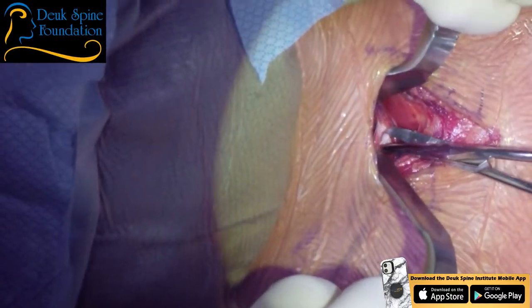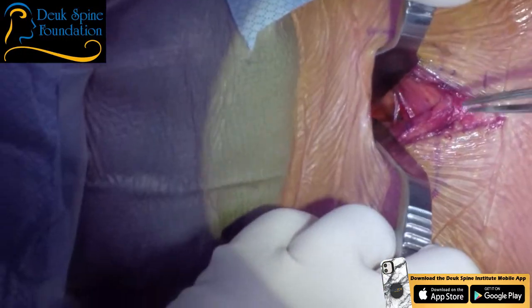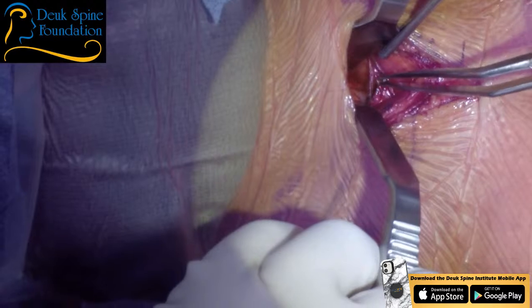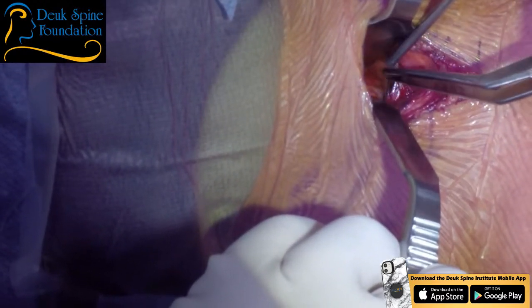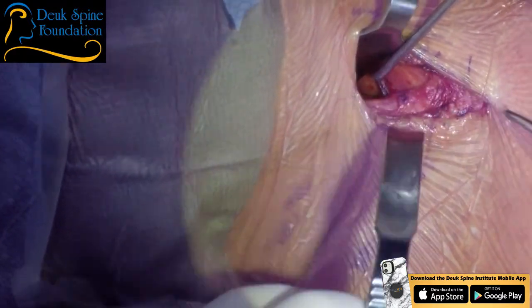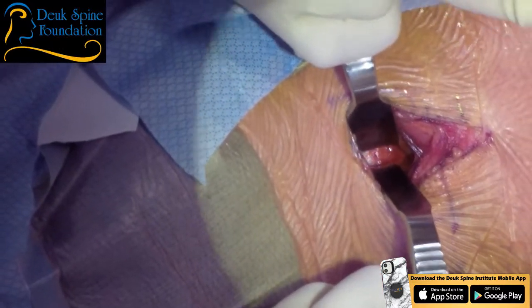Let me have the scissors, and we're gonna need the scissors and bipolar. This is just some fascial attachments here. There usually is a little vessel in here, like a vein. So I'm just being careful. This is the superior margin of the omohyoid, by the way. So if we have to sacrifice the omohyoid, we can. We can safely take it. It won't affect the patient very much, but I don't like taking any normal structures unless it's absolutely necessary.